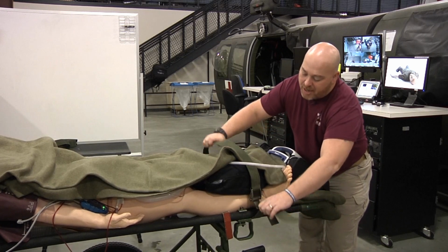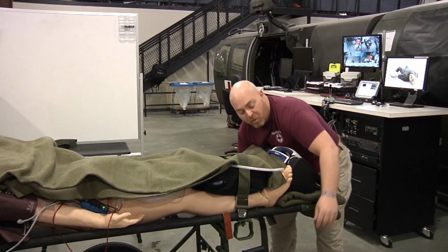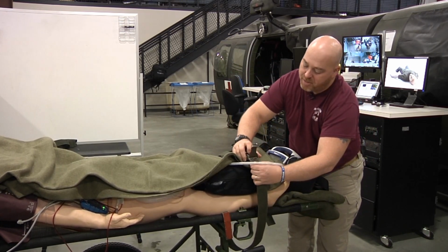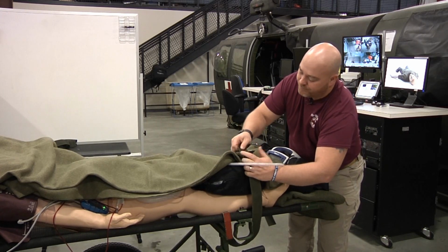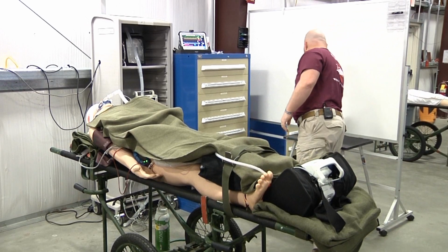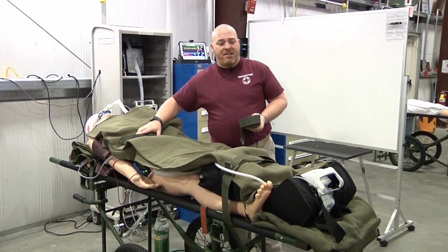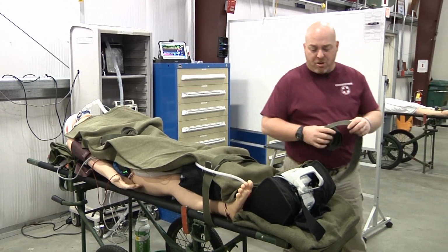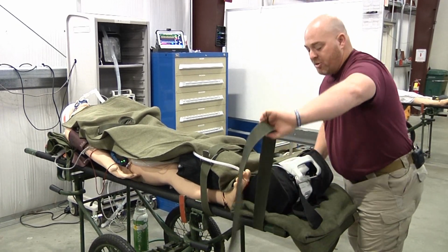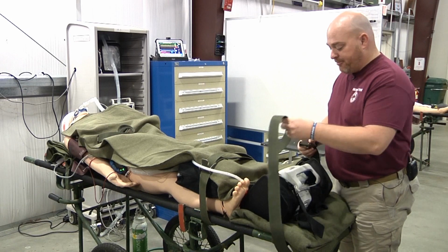If you put the litter straps over the vent on his legs, it's kind of like a twofold thing. You're getting the equipment secured and you're also securing the patient to the litter. Place a litter strap above on the chest. And then also don't forget to strap down your monitor on the bottom. You don't want this to fall off during transport either. You need to make sure that all of your equipment and your patient is secure.